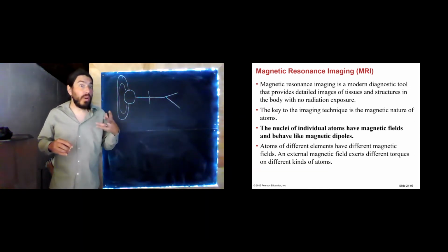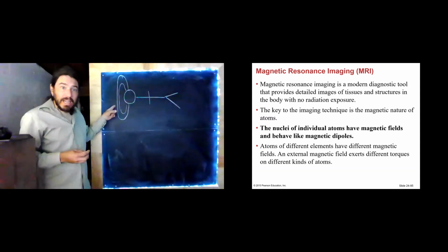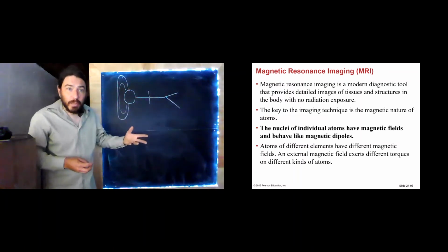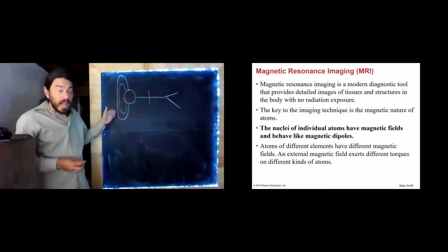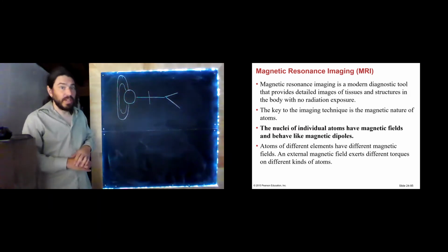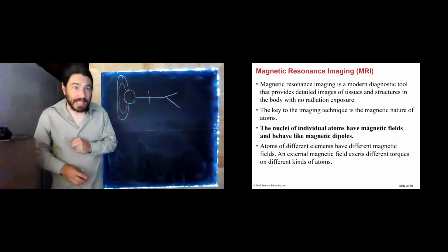So a wire with no resistance creates no heating. So it's cheaper for them to keep these coils near absolute zero than it is to pay the heating bill to disperse the heat that would be generated if these were non-superconducting coils. That's pretty crazy. So they run a huge current through this coil, which of course creates a magnetic field.